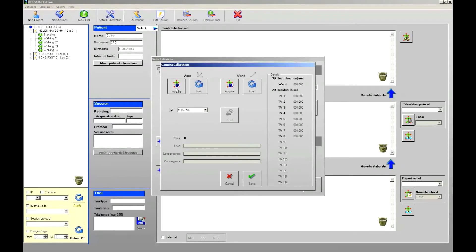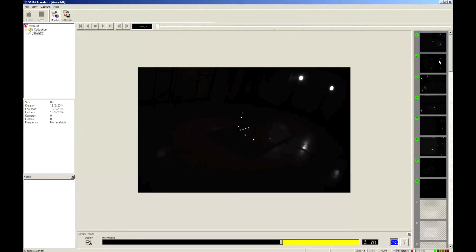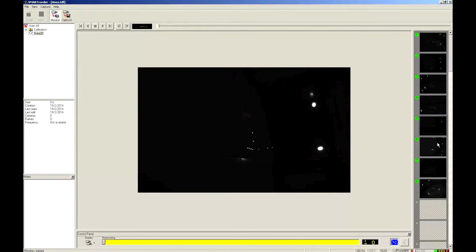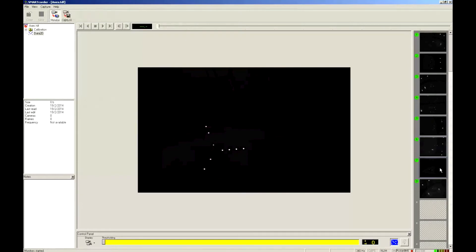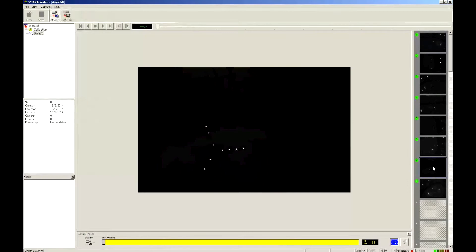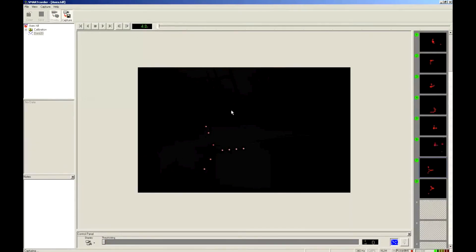To start the calibration procedure, I can press the acquire button. I have to press the monitor button to start the live monitor so I can check the single camera view. Remember that during the calibration procedure it is important to avoid the cameras having phantom markers or markers different from the ones on the calibration object in their field of view, so please try to remove any disturbance present in the captured volume. During the static calibration, the markers on the object have to be detected by at least two cameras. By pressing the acquire or capture button I start the capture — it is suggested to record for three to five seconds. To stop, I click capture again and then save to store the recorded data.